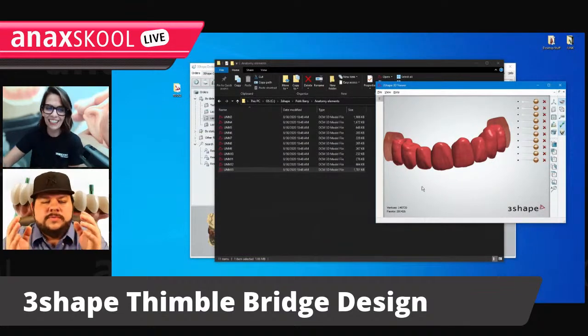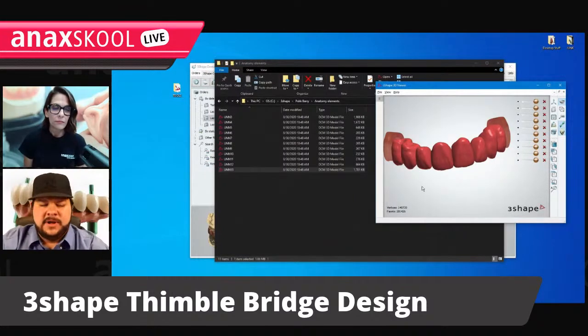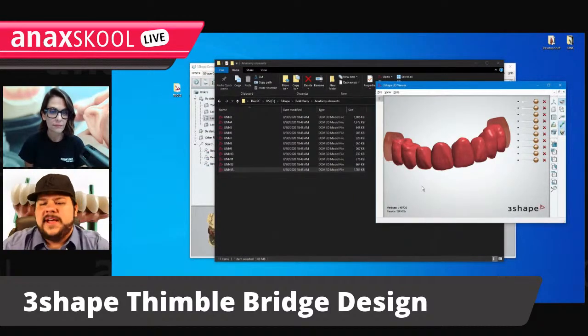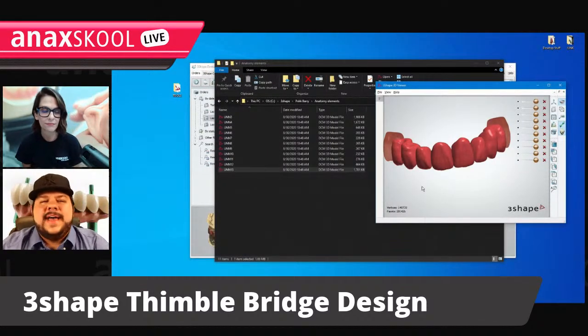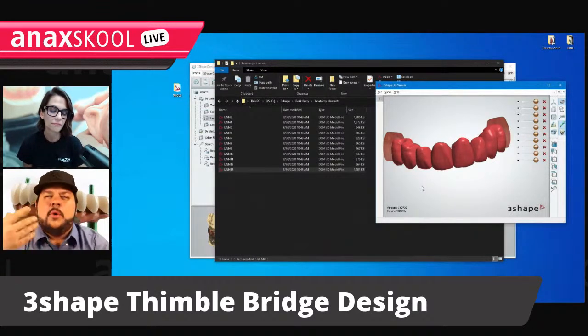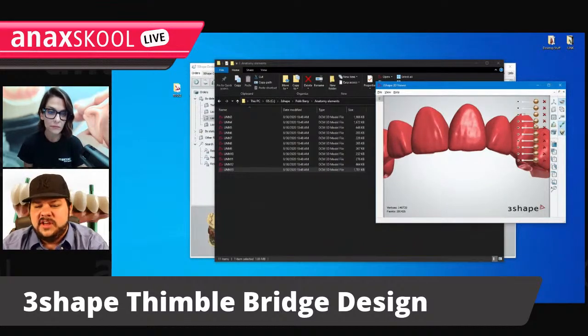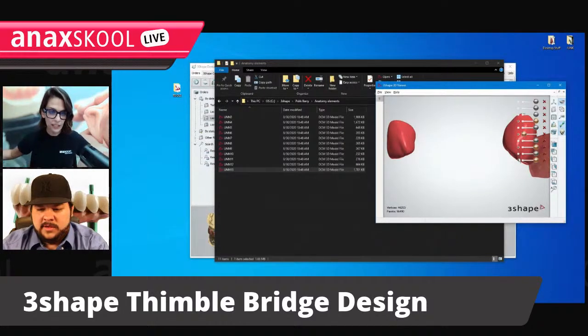So what a lot of people do is they go to design their case that they did months ago as they move forward in the treatment plan, and they bring in their diagnostic plan so they can see it and redesign everything so it's very close, or they morph to it. Blech. Don't morph. Why morph when you have these elements right here? Let's call them elements. Think of these as each one's just a little tiny bit of the overall picture.